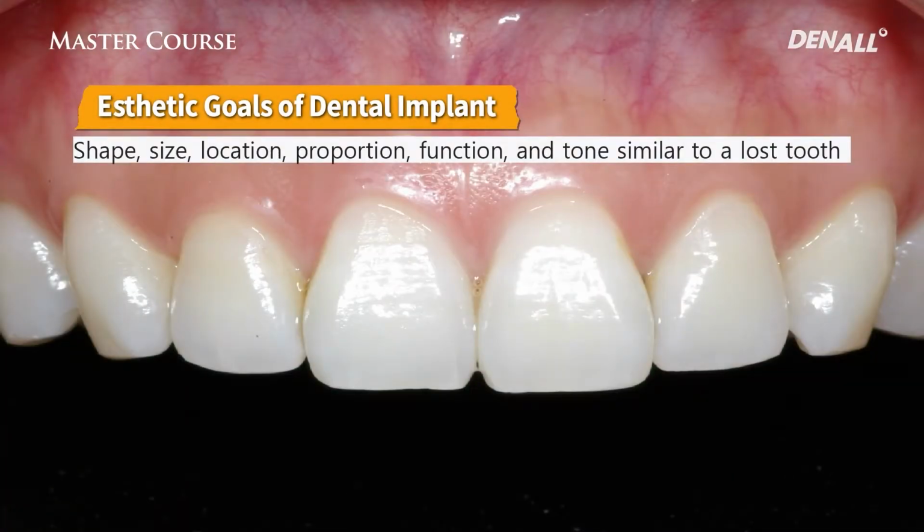When we look at implants, we need to look at the shape, size, location, proportion, tones. They should be similar to a lost tooth in the upper anterior region to achieve aesthetic prosthesis.